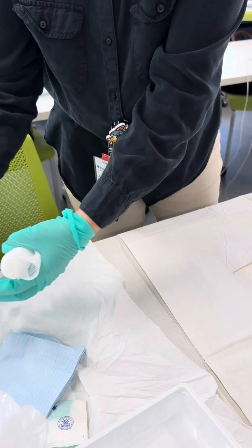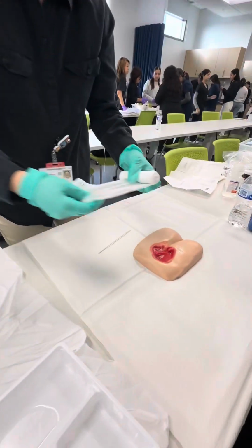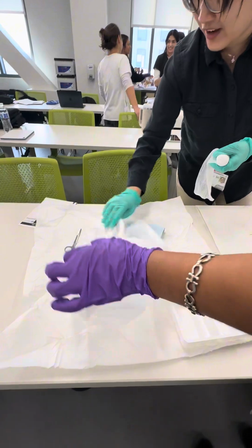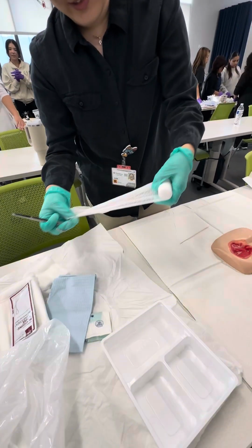So you just do your best. Okay. And then do these. Obviously this isn't a very big wound. It's a baby. It's probably only going to take like two gauze. Okay.